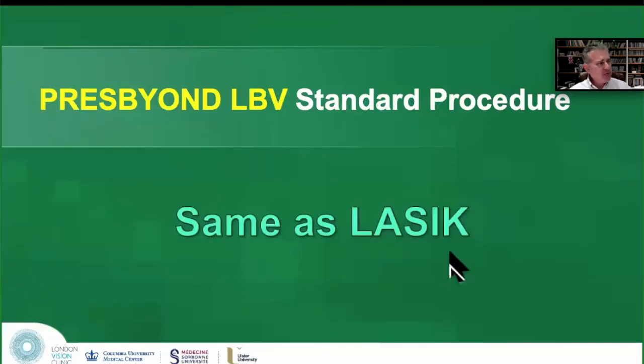How is Presbyond performed? Well, you have to know how to do the pre-op testing and the standard operating procedure refraction test and the +1.50, it's being called the Reinstein +1.50 test, to determine the candidacy and exclude those 3% who aren't candidates. But essentially the procedure is the same as LASIK.